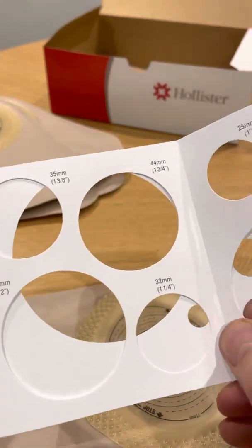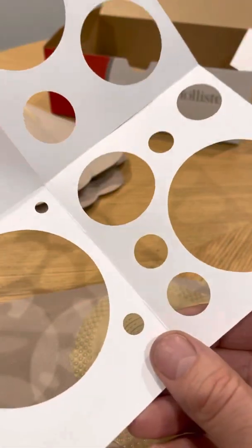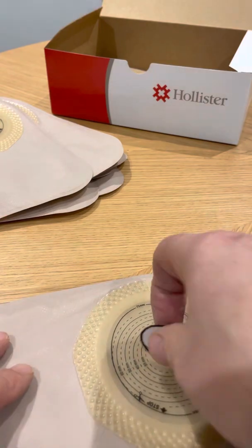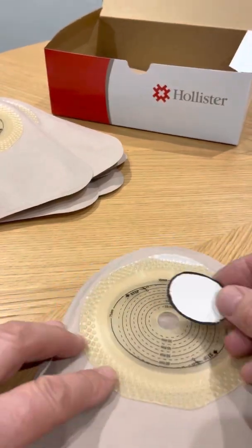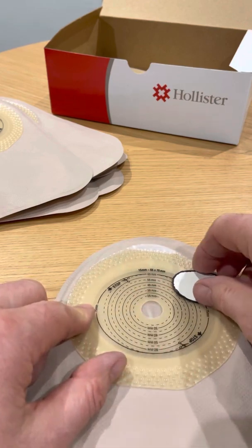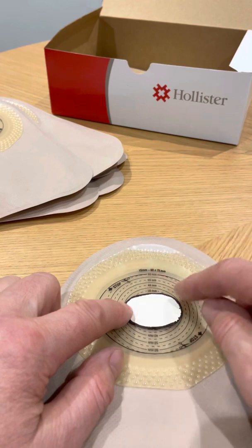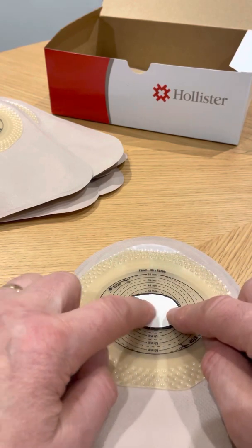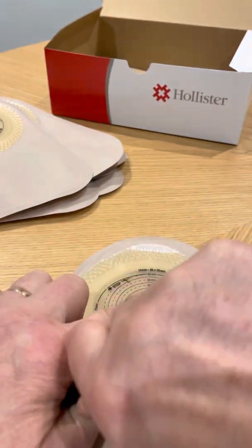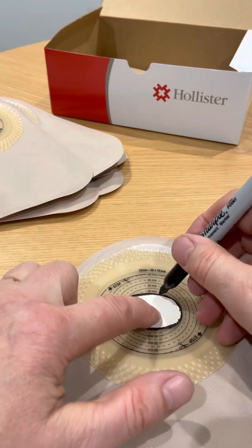That's if the circle is actually round on the patient. It may not be, it may be oval shaped. So here's my template, and I'm just going to line it up using the concentric circles. Just line it up so that it's in the middle of the circle, both at the top, bottom and the sides. And I use a Sharpie pen, and I draw around the template.